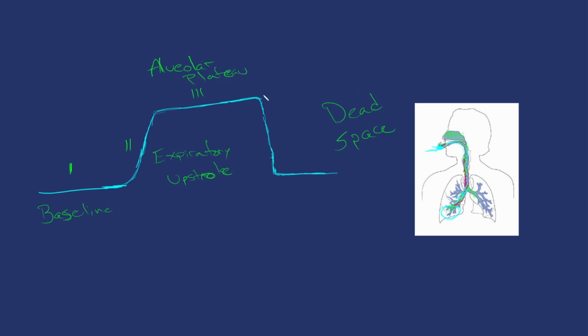And then what happens is eventually this gets to the highest point in there, and that's going to be right here. And this is the one that we're paying attention to when we're doing our capnography, because this is called the end tidal CO2. Okay, and that should be the 35 to 45. Then, as we start to breathe back in, that level of CO2 being detected at the meter drastically drops off as it goes back to atmospheric conditions. That's going to be stage 0.